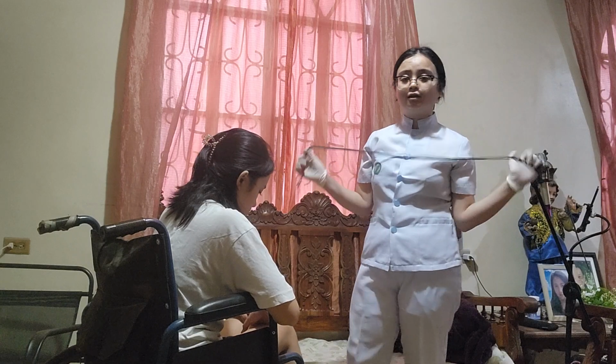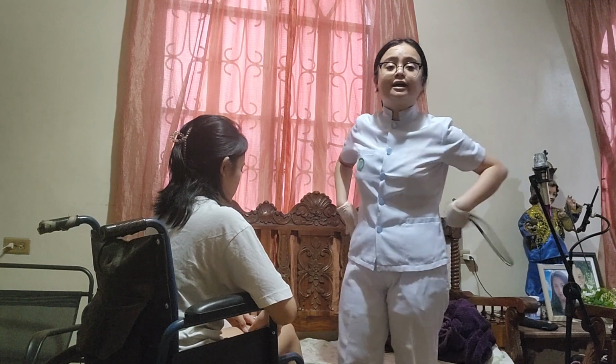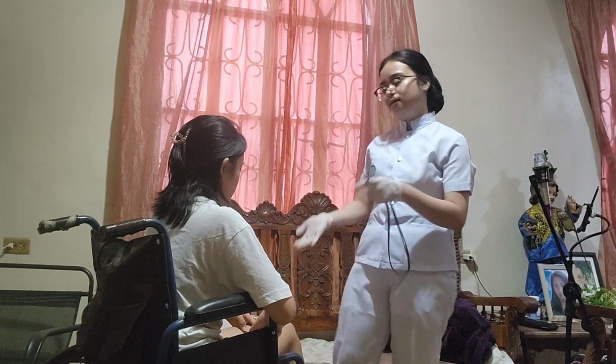Assume that I have already performed hand hygiene and hand rub and put on my gloves. I will put the gait belt again on the hips of the patient to provide support when you are assisting the patient in standing up and transferring her to the bed.